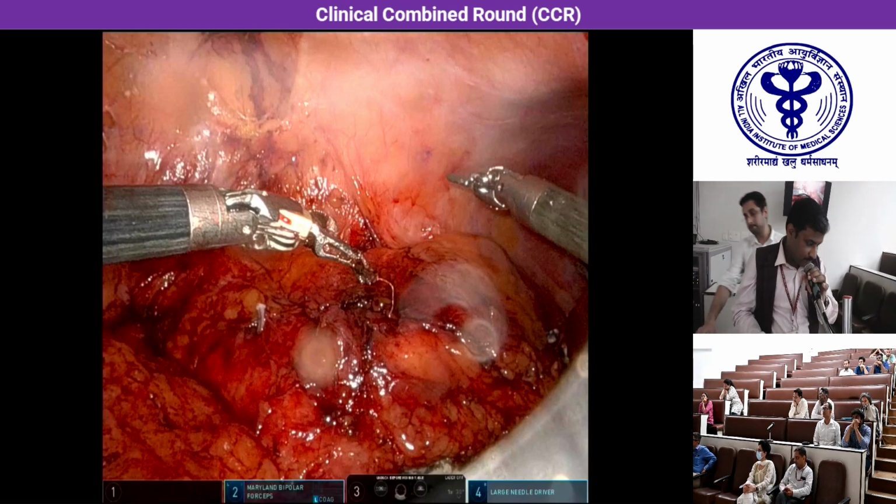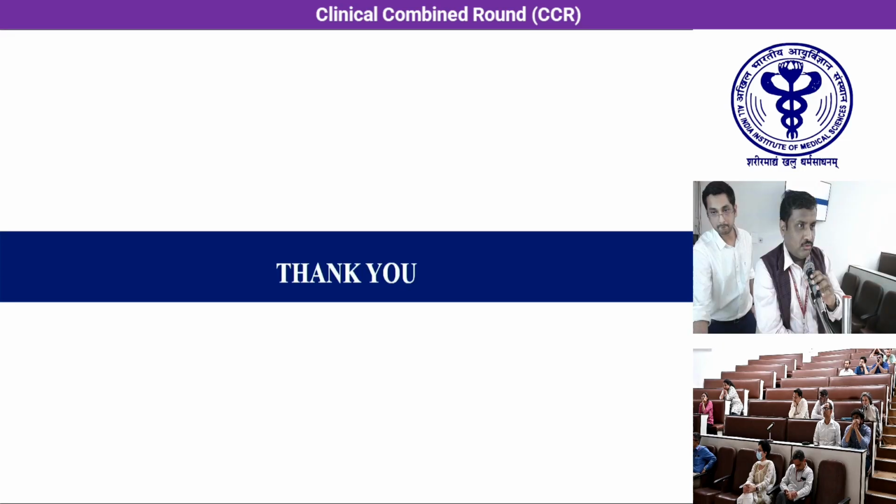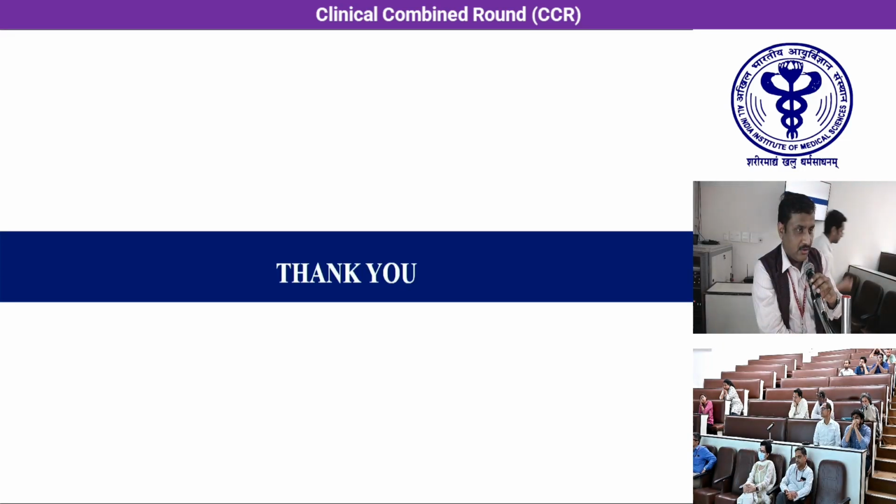So, thank you. As Nilesh has pointed out, IVC thrombus is actually very challenging surgery. If you do not have lots of experience, these patients can have significant bleeding because the IVC is completely occluded. There are lots of collaterals around the renal, kidney, and also around the mesentery. So, by the time you reach and do a nephrectomy, you must have lost a significant amount of blood even before you open the IVC. So, it's always a challenging surgery.